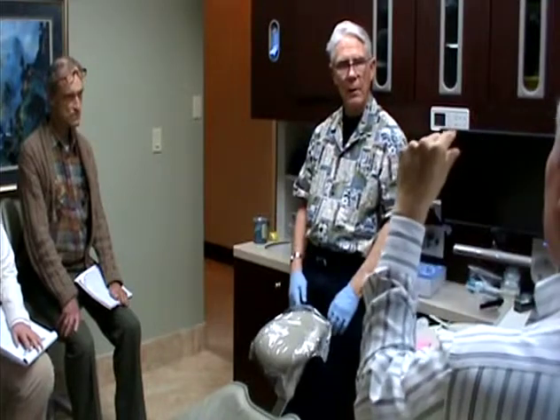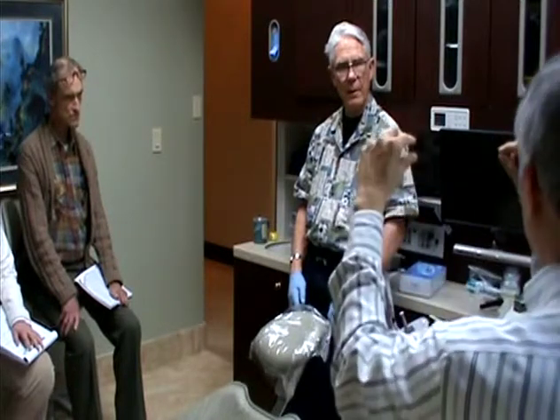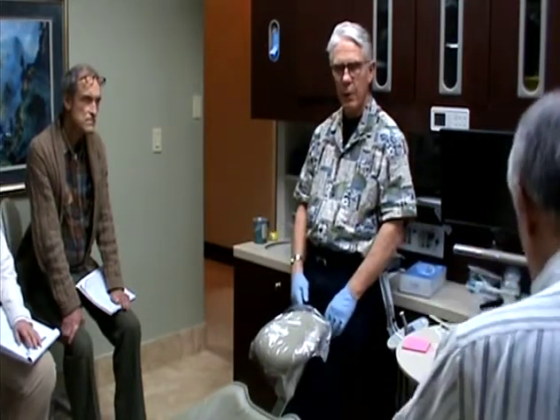So instead of using the Bowley gauge to measure the narrowest part of the paper indentation, you just use the paper layers directly. If you want to measure with a Bowley gauge and set the Aculiner to that level, that's fine. And then measure for the other side and set the Aculiner and do that side, fine. I just think it's a lot easier, just put the paper in there, it's real quick. But you can do it either way.